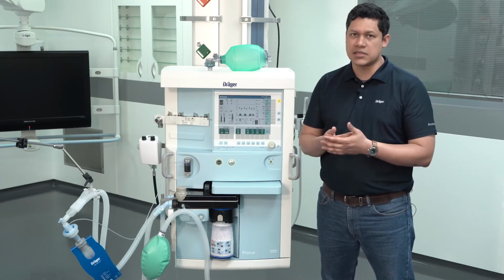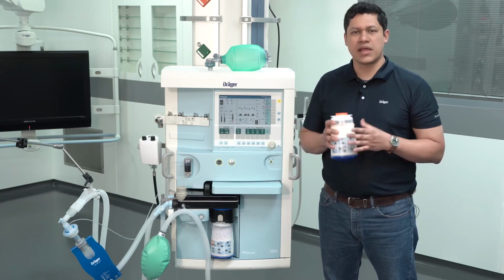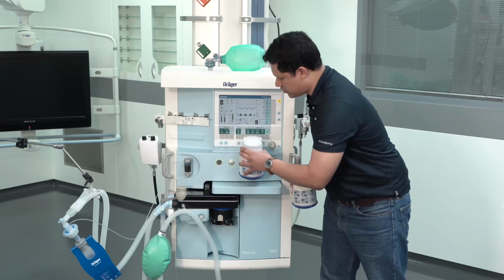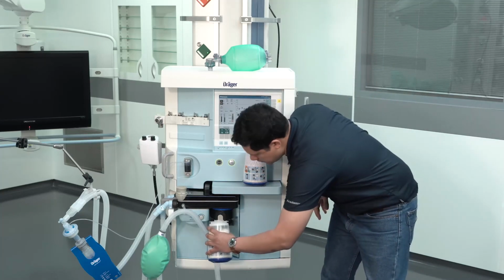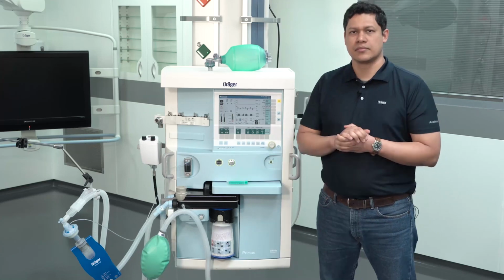If that is not the case, be prepared to exchange the soda lime. When soda lime exchange is required, press the button to release the cartridge. Take it out. Take the new cartridge and remove the red cap. Insert the new cartridge and lock it back in its place.